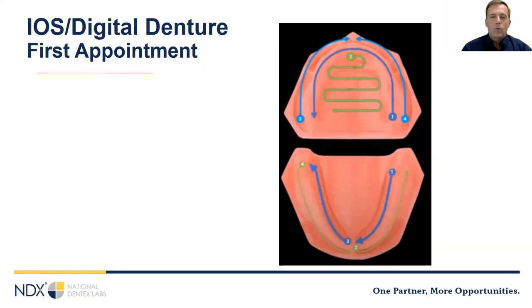As you guys know, scan path is the key to getting good, consistent results. With dentate patients, it's a little bit easier because usually we scan the teeth as a stable point of reference, and then we add data to that occlusal data.